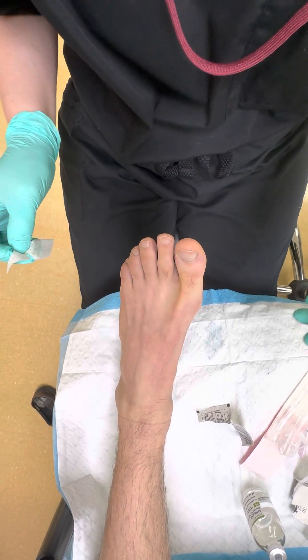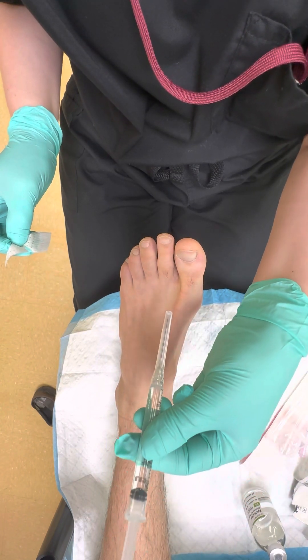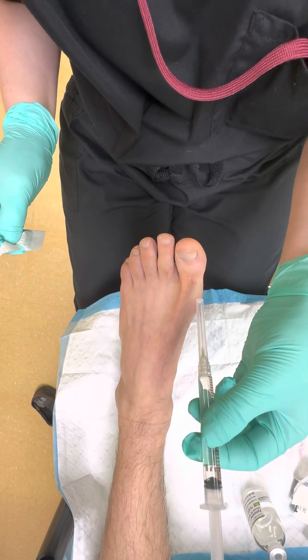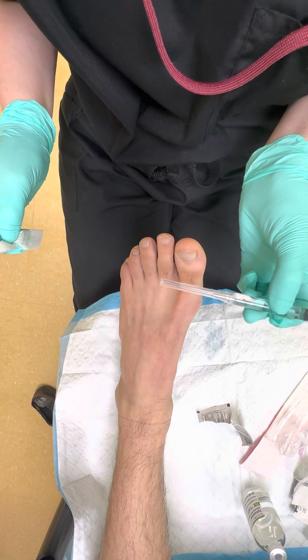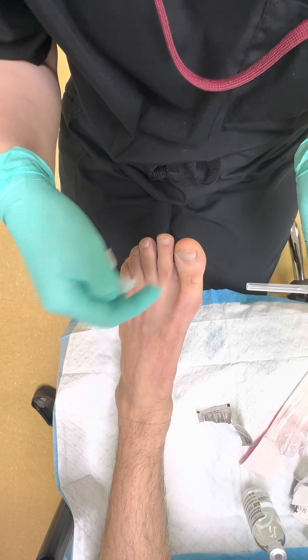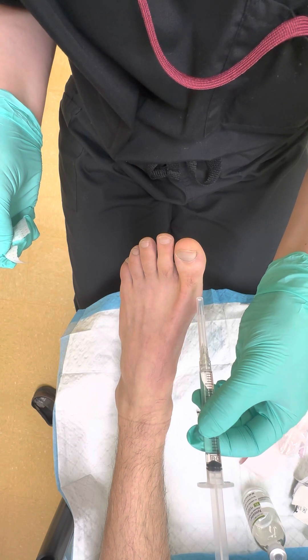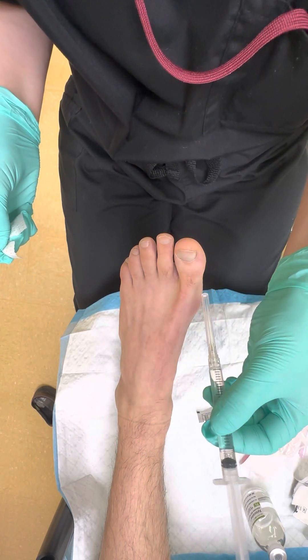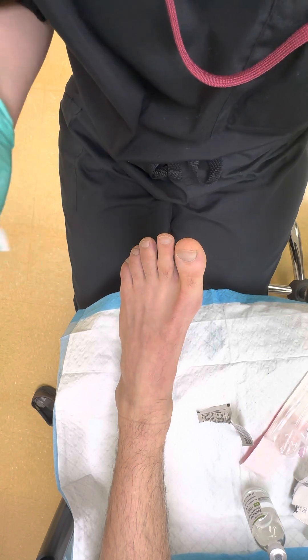You can do this injection a number of ways. The two-stick method: go dorsal and advance plantarly while injecting, then pull out and repeat on the lateral side — hitting the dorsal proper digital nerves one and two and then the plantar digital nerves. Alternatively, the three-stick method: go dorsal to plantar, then without coming out of the skin turn toward lateral, then go plantar. It's your choice, but we'll do the two-stick method.